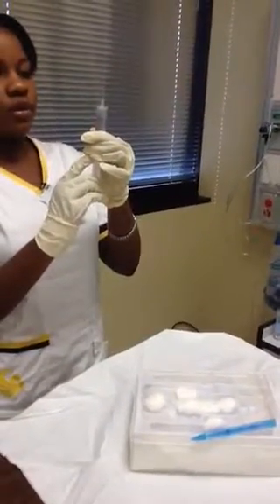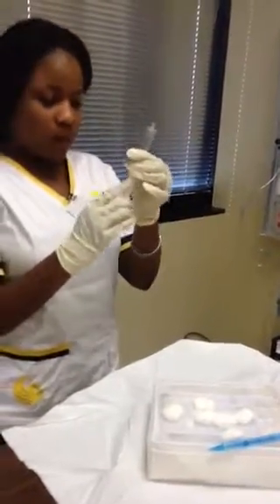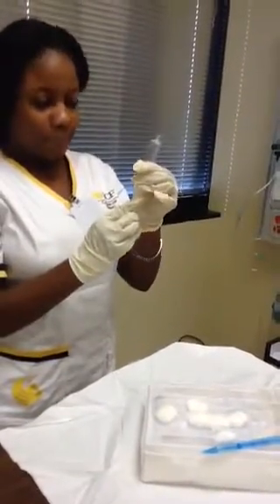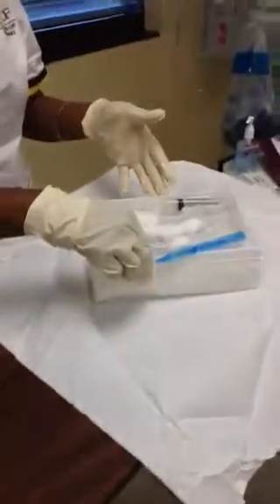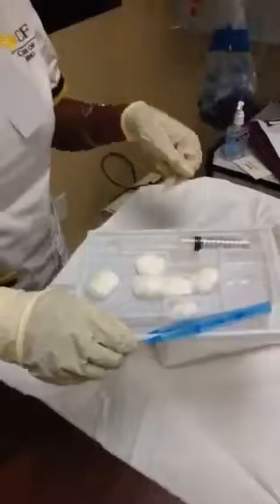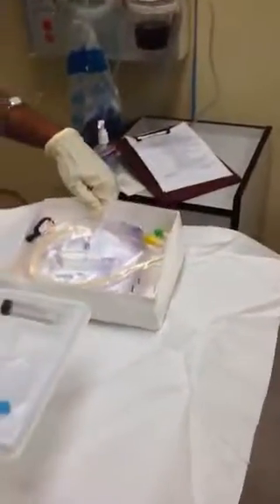Exercise my plunger. Okay. And leave it on this side. And then I'm going to move this, but make sure that I stay on the sterile field. Don't go over it.